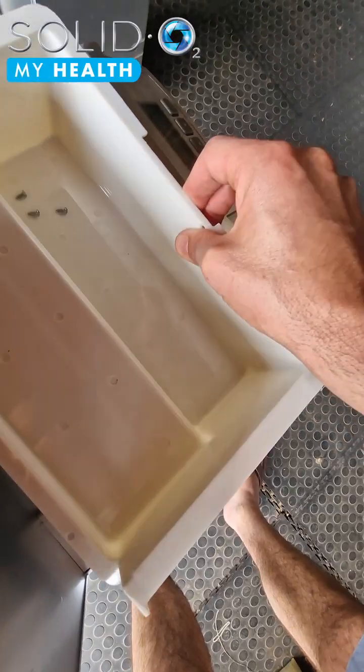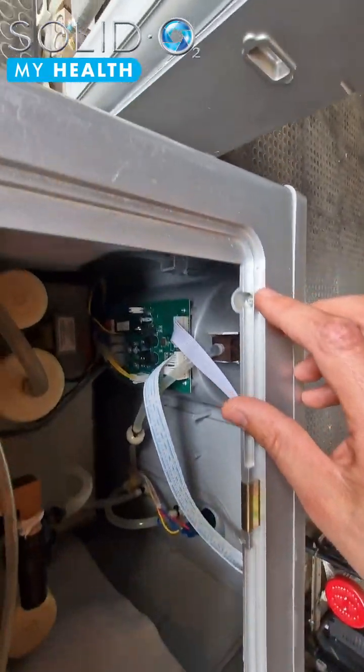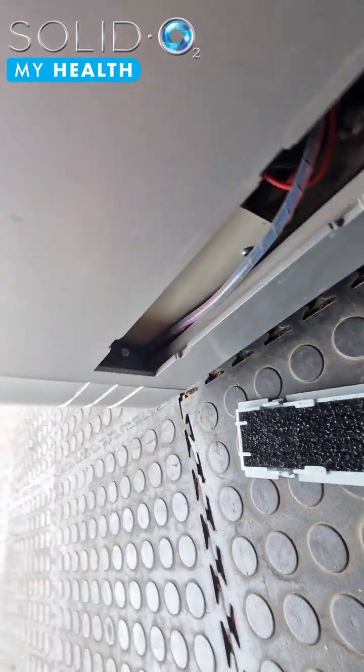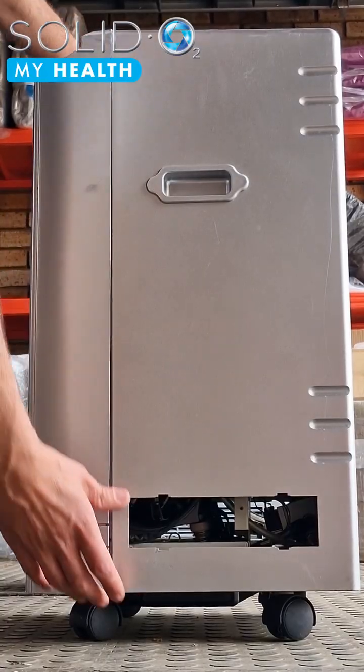To get inside of this, we're going to have to remove 3 screws so that we can remove the top tray. Once the top tray is removed, you'll notice that there are 2 screws exposing what's holding the front and back covers together. But hold up, the filters at the bottom that we just removed also have 2 hidden screws. This is going to enable you to remove the front and back cover. Be careful when doing this.